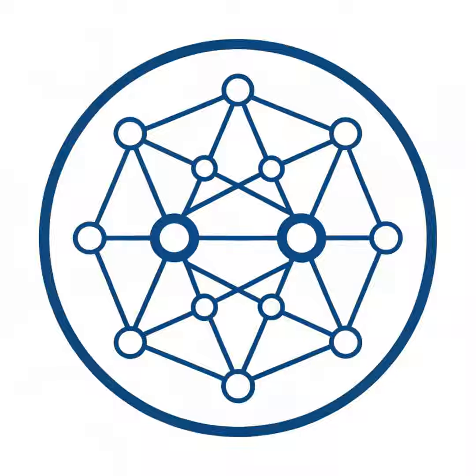Something about top K. Yeah, an optional step, top-K component selection. After all the filtering, they can choose to keep only the largest candidate regions, ranked by volume. Maybe just the top one or top two. And did that help? Just keeping the biggest ones. Interestingly, yes. They found that keeping only the single largest candidate, top one, actually gave the best results in their experiments. Really? Fewer candidates led to better final accuracy. It seems so. They suggest it acts like a kind of spatial attention, really focusing the detailed second-stage model on the most probable area, reducing distractions.